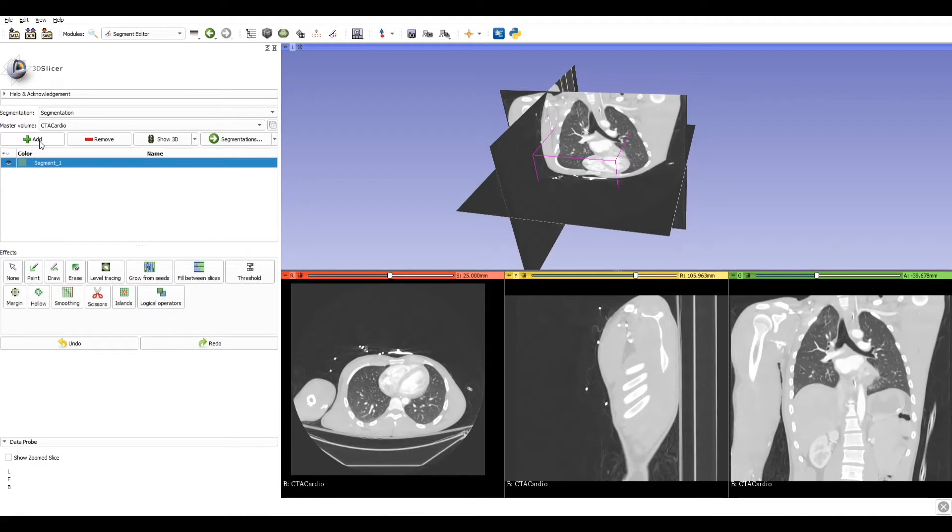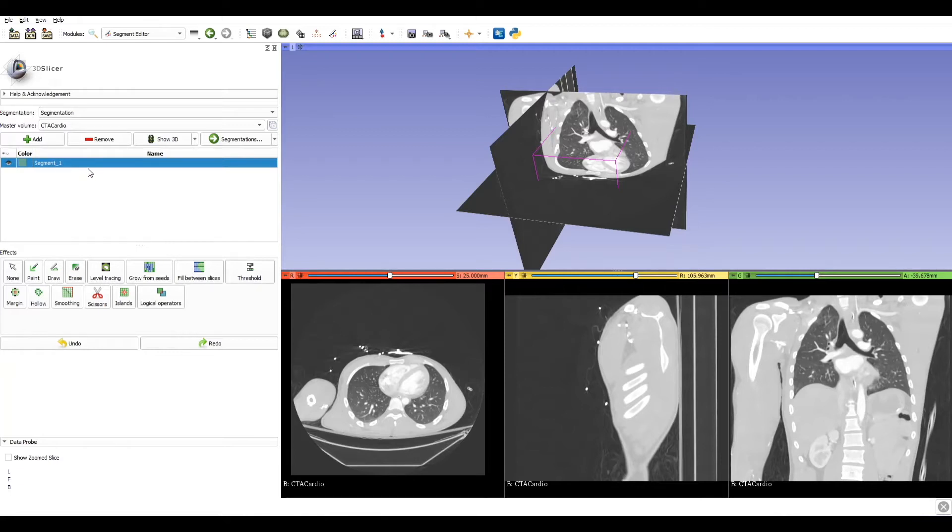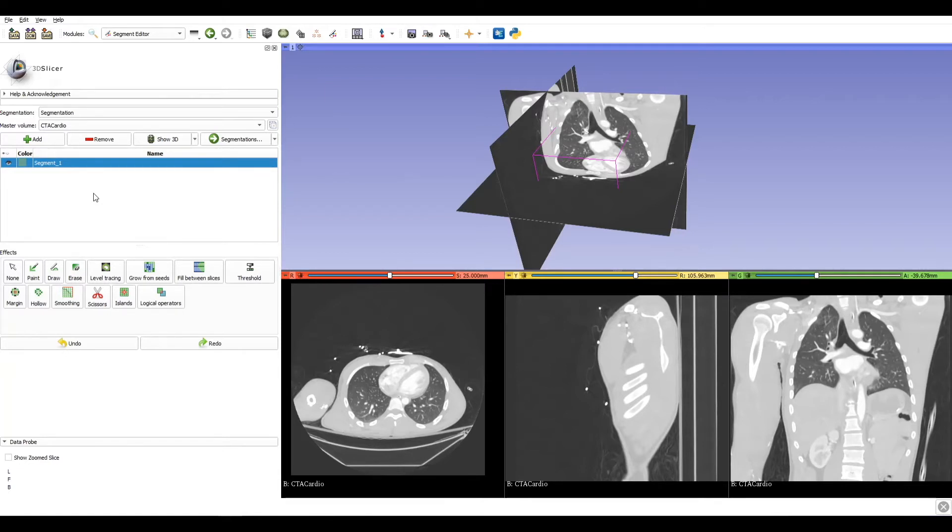Segmenting means selecting a group of voxels that are part of the same organ or volume that we want to analyze. Creating this segment is something like creating a new layer on Photoshop or Illustrator or AutoCAD. Once the layer has been created, we can perform our first segmentation.